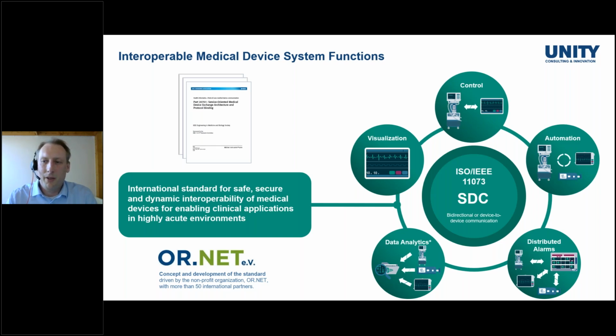And this includes also something that we call in the SDC world alert signal delegation, where the device at the bedside stays silent and the alarm is only sounded there, for example, where it's really needed. The last point here is that you can, of course, make use of the data available for analytics, research, and so forth. For that purpose, you would typically use the bridge that I just described before, and probably the analysis is way better done in a system that maybe has a FHIR interface.